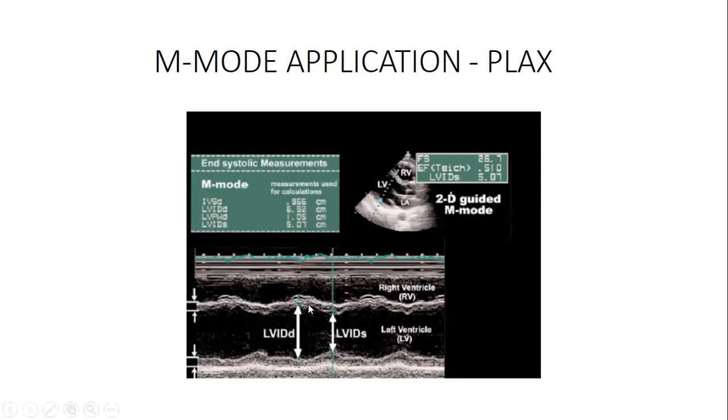Okay, so this is where you check and quantify LVH. The question is, what is LVH? LVH is left ventricular hypertrophy. Now, how do you quantify it? You look at this. From here to here is a chamber, the left ventricle. This black area is the blood within the left ventricle.